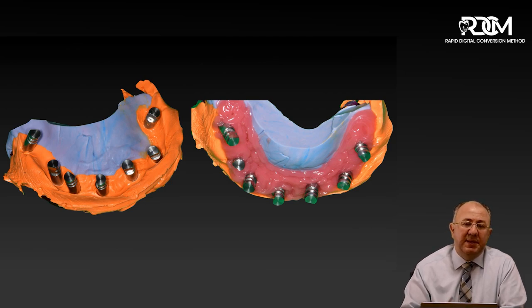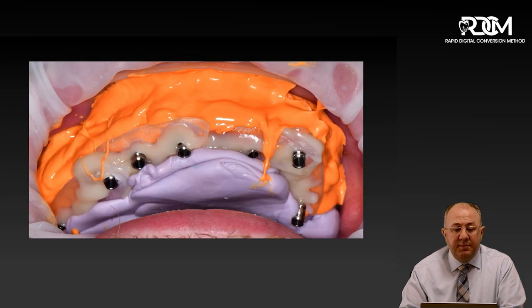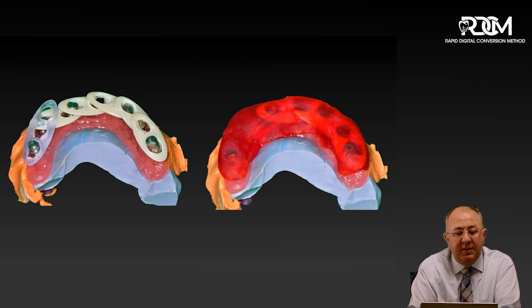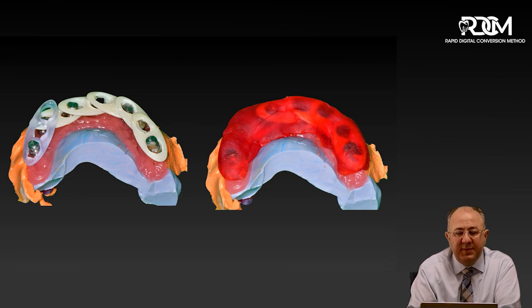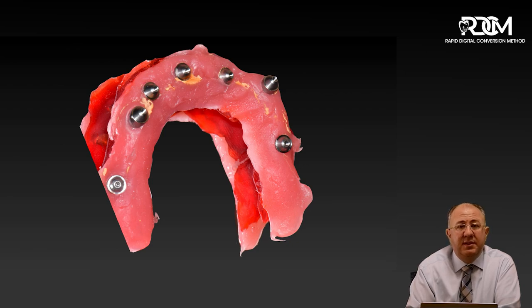The whole process takes me 10 to 20 minutes, or 30 minutes if there are any challenges. Then I connect the lab analogs to the temporary cylinders, use soft tissue replica, and use the same S-plates to connect all those lab analogs. I adjust the S-plates so they slide in place, start connecting them with pattern resin, and add more resin — adding resin in increments to minimize the amount of shrinkage during the resin curing process. This gives me my final accurate resin model.